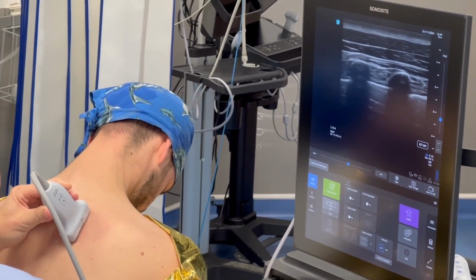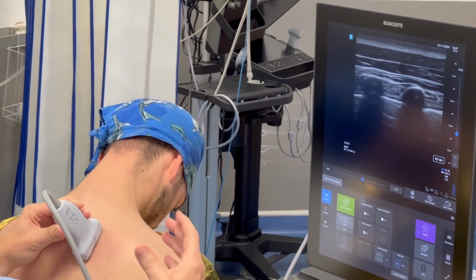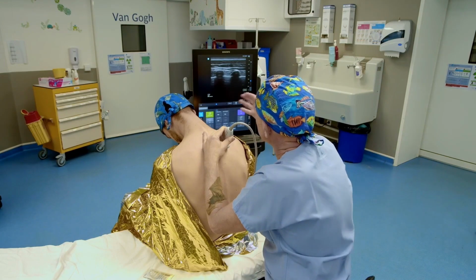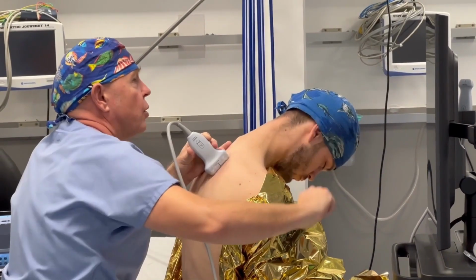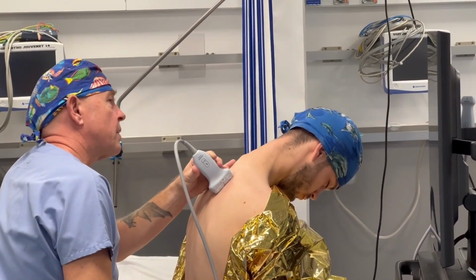Thoracoabdominal surgery, the ESP block, the erector spinae block, is a very good block, for example, in cases of trauma to the wall, or for instance, for acute lumbago. And with all that, you reach only the bone and you inject. The paravertebral at this level is still the most effective block, but it requires a bit more expertise.